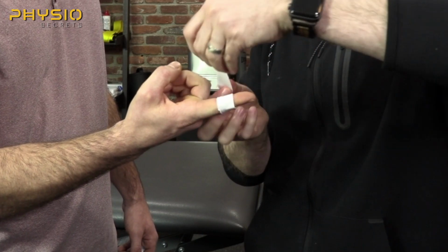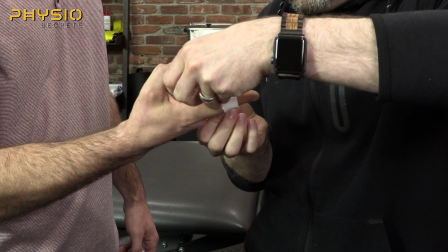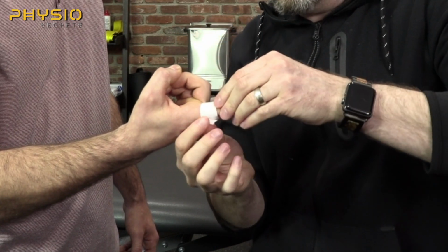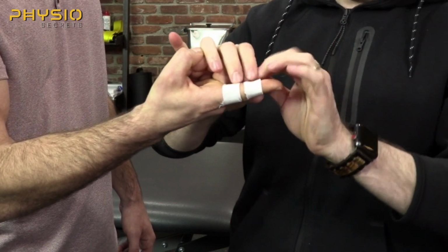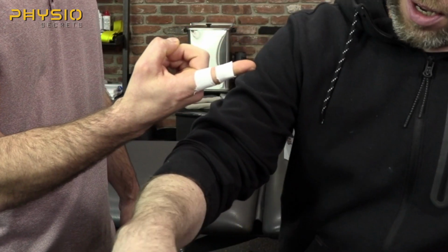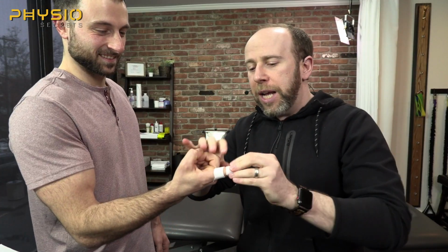And I'm going to get this guy below the joint line here. And that's anchor number 2. Hopefully you guys can see that. So we have 2 little anchors there. And that's one of the reasons I hate athletic tapes, because you always get these little strings that kind of bug you. Okay, so that's my anchor. So now I'm not going to anchor onto his skin. Athletic tape doesn't stick to skin very well anyway.